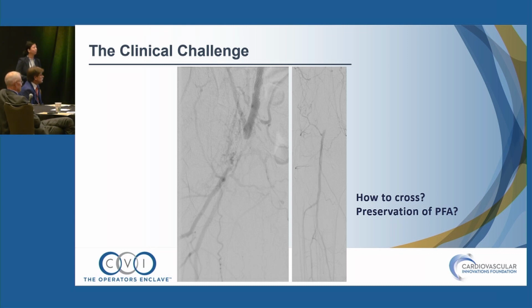Chris, I think Dr. Lee's question was, what approach would you take in this situation? Would you go antegrade, retrograde, and how would you do it retrograde if you were going to? I think the last two, Ben's talk and the comments here in this case, represent the ideal situation for collaboration. We should be thinking together, unlike some of the articles that have been in press in the last week, which we need to get away from. We need to get back towards bringing out the best. Your case was phenomenal, and it's everybody working together. Some people wouldn't think of the profunda question because they didn't have your perspective. I know Jun would. So I'm with you.